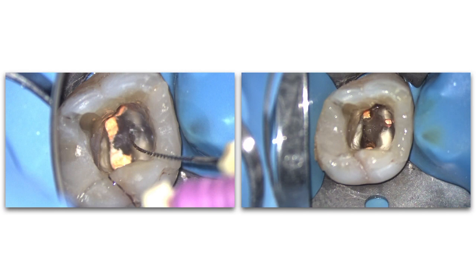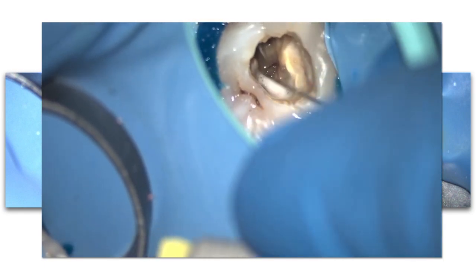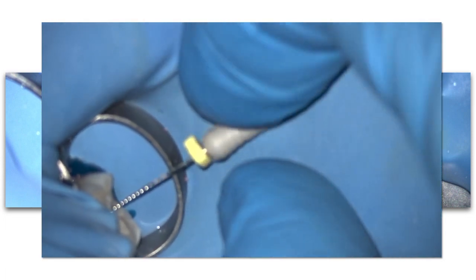So let me show you another thing which is more interesting. It is the use of size 8 in this case. Here I am really not able to catch the orifice of the canal with size 10.